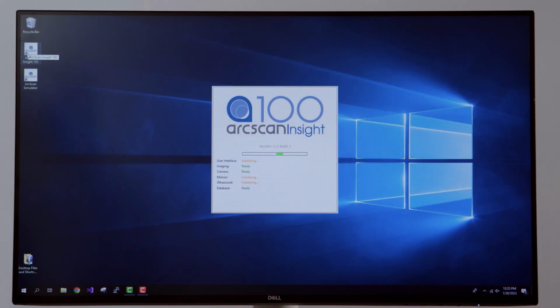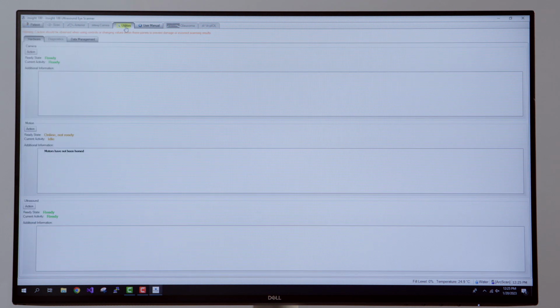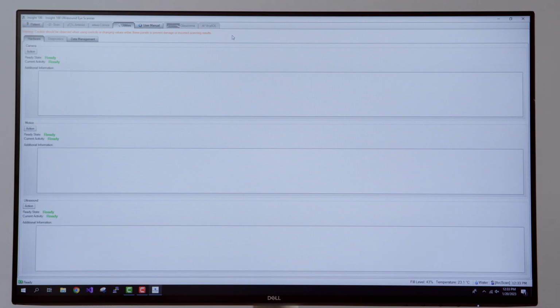You'll notice the Utilities tab. You'll see that it is yellow until all the self-checks are completed. To continue the self-check process, we need to draw distilled water into the device. Fill the water to half. Until an EyeSeal is in place, more than half will overflow the scan head. Motors will calibrate. This is what we call homing. You will see that all the indicators now are ready and green, and the tab turns gray, meaning ready to scan.